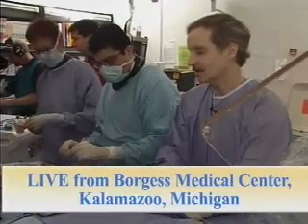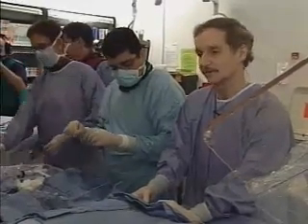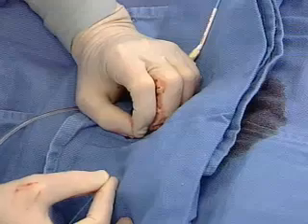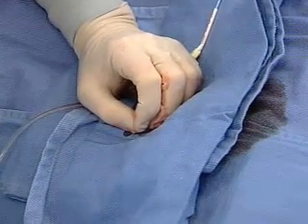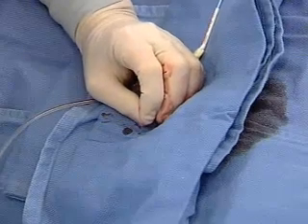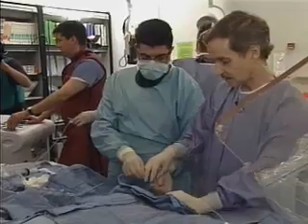And I know in peripherals as well, we're doing the same thing. We're going from normal to normal in the superficial femoral. Unfortunately, the sirolimus is not yet available for the peripheral, but it has made quite a difference going from normal to normal. Right now, you getting the stent?